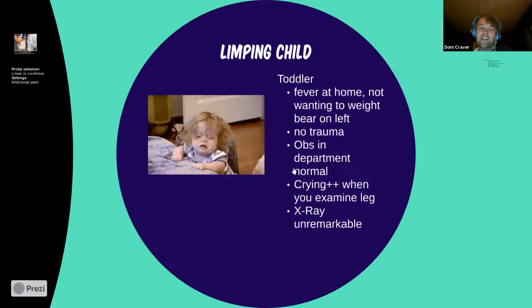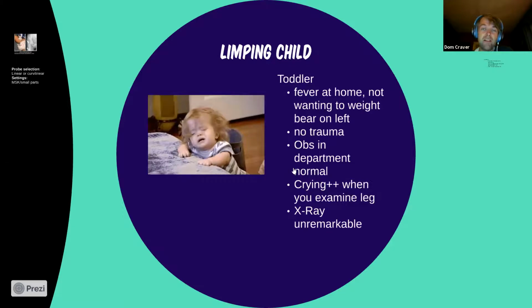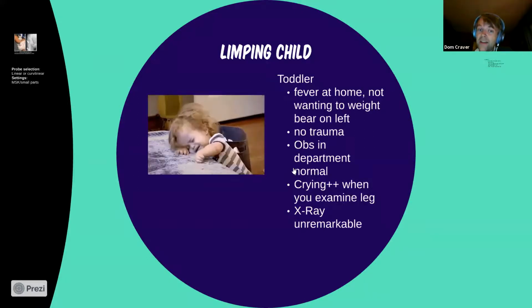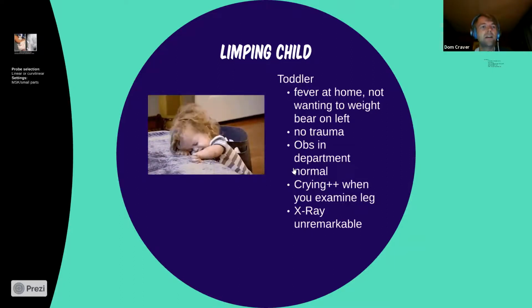And you do an X-ray, and it's normal. You do a hip X-ray, or you might be thinking, could it be a toddler's fracture? Is there any indication of that? All normal. Okay. I even had a case once where the kid refused to have an X-ray, had the same ultrasound features that I'll show you later. That's how upset she was.